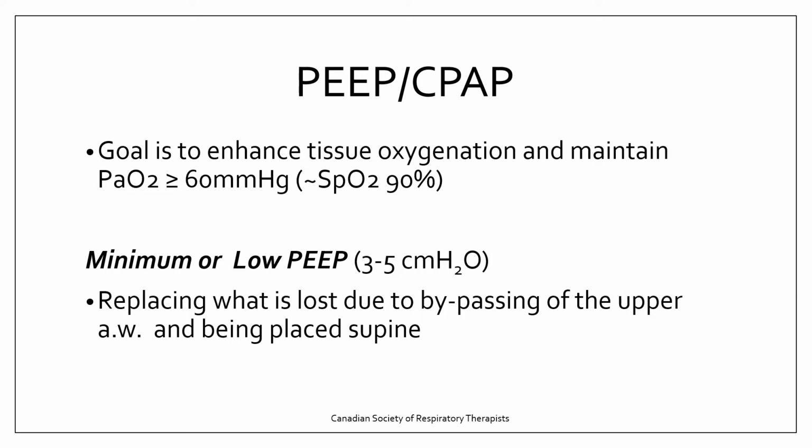during exhalation of normal tidal volume. So we don't want to keep opening and closing the alveoli on every breath and causing atelectatic trauma. So we need to make sure that we have an appropriate level of PEEP.